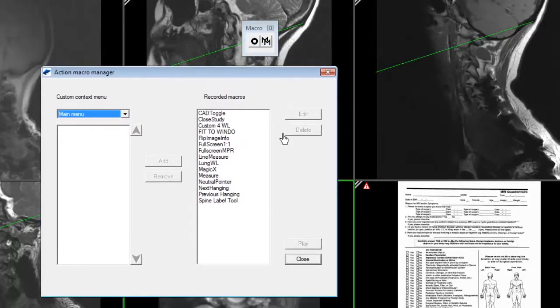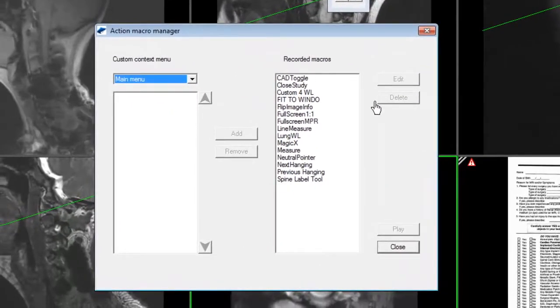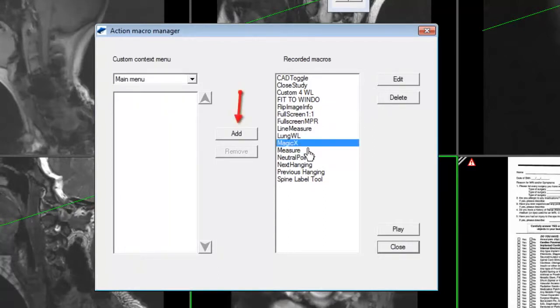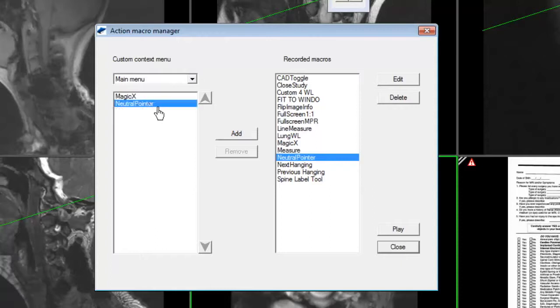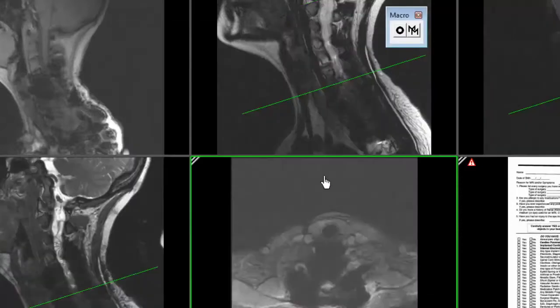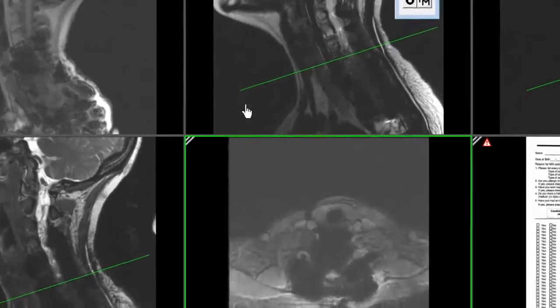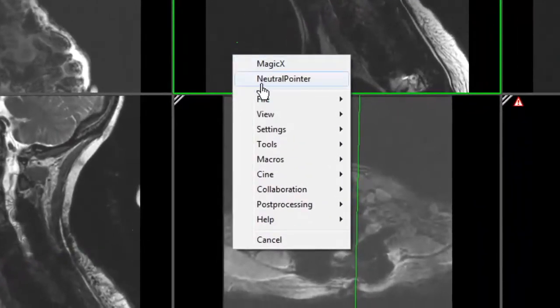You can also add keyboard macros to create a custom right-click menu from this window by highlighting the desired macro, then clicking the add button. You can use the arrows to re-sort the order. Right-click anywhere in the viewer to view the custom right-click menu options.